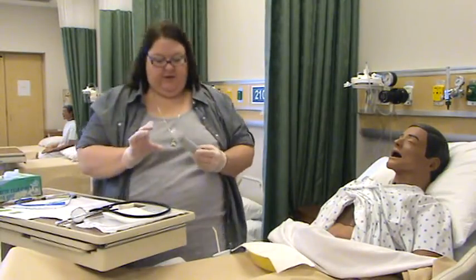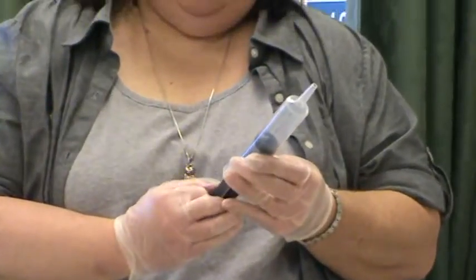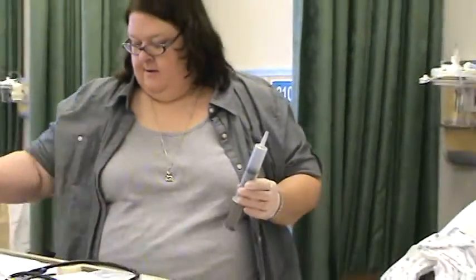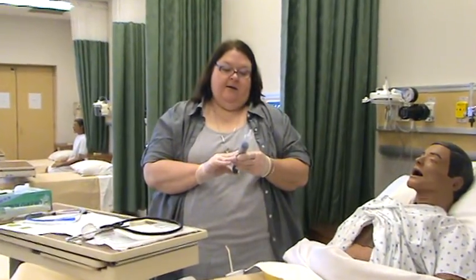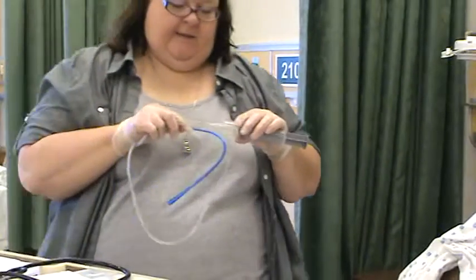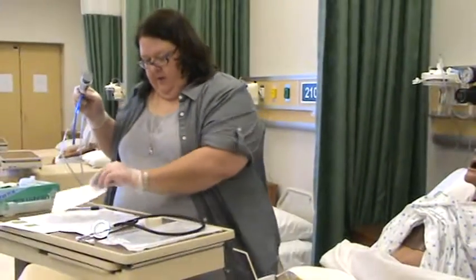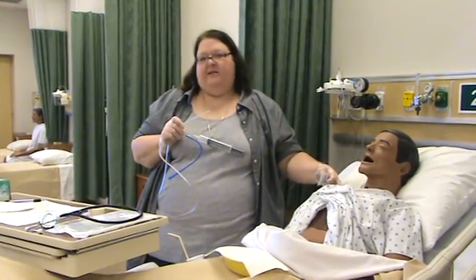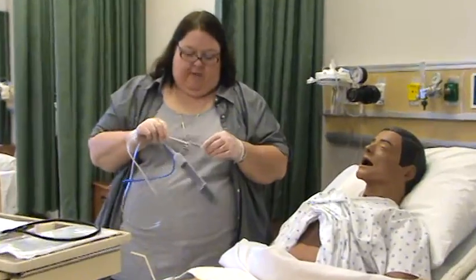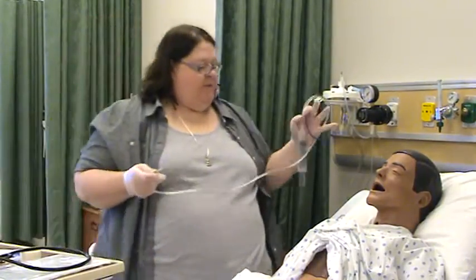Let's get this syringe out and put 20 cc's of air in it. Now, in the real world on a human, you would lubricate this a lot because that's what will help it be less painful. Obviously on mannequins we don't put lubricant down them, so I'll take my water-based lubricant and put a big blob right on the tip of the tube so it coats their nose and goes all the way down. Mr. Pooh, we're ready to go.